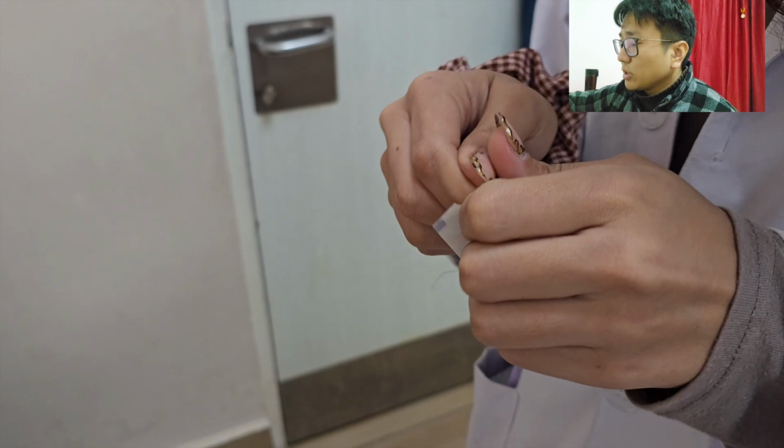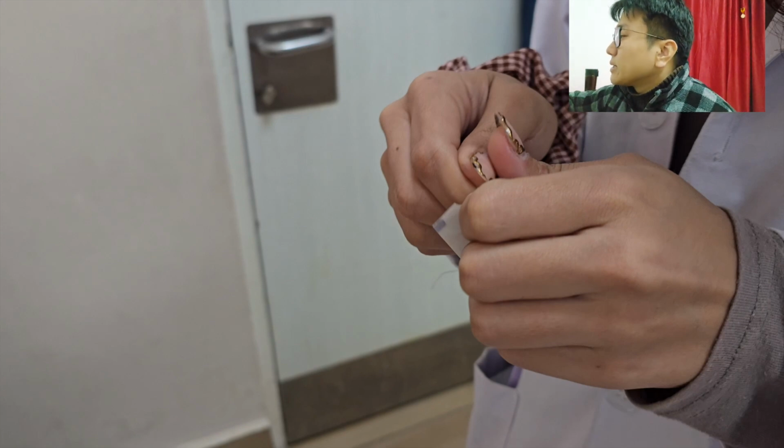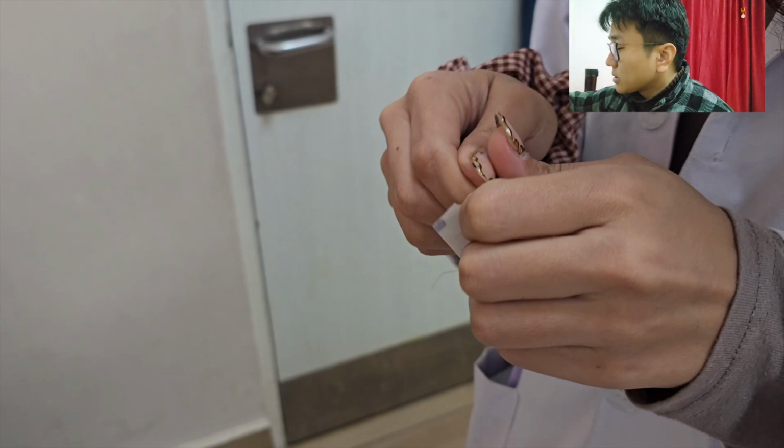So the usual reading is that if it is below 10, the patient has some kind of problem related to dryness of the eye. So we can supplement the patient with lubricants. And if it is very severe, then we have to do other treatments for dry eye disease. Also we have to rule out any diseases which can cause dry eye, such as systemic diseases.